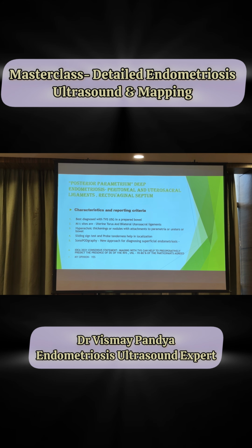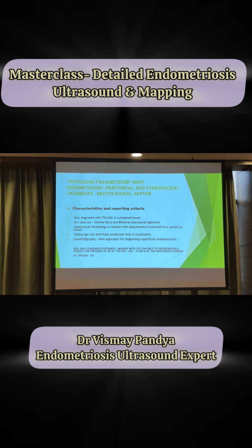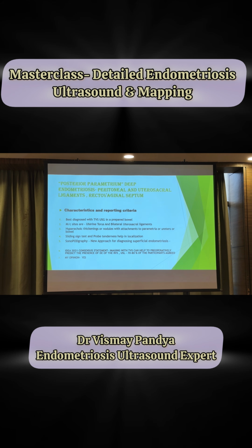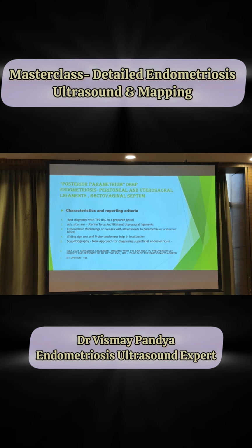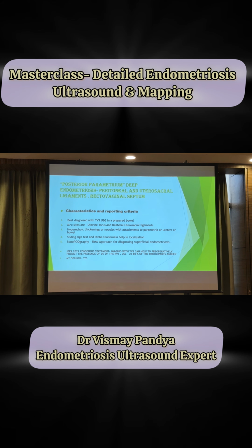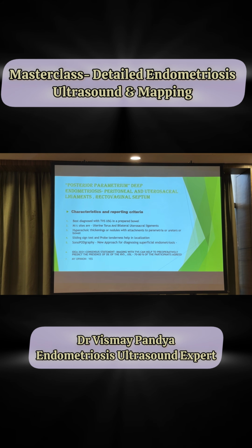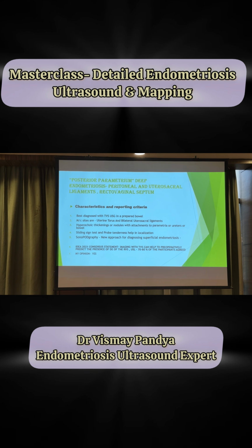So now the posterior parametrium. According to IDEA, the uterosacral ligament, the prerectal space, and everything has been converted to one terminology, that is posterior parametrium. They don't differentiate now. They say rectovaginal septum, uterosacral ligaments, and peritoneum are all a part of the posterior parametrium and have to be reported as such. It should be done in a prepared bowel.